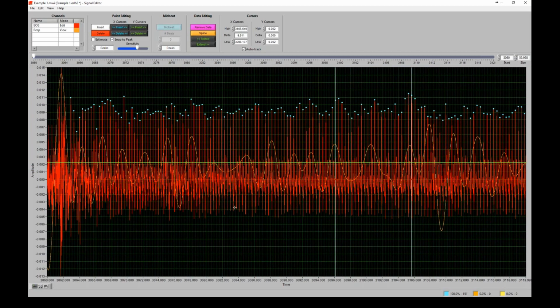If we zoom out, we can confirm that. So again, this sort of thing is completely acceptable to do as long as we, at the end of the day, end up with at least 30 seconds of data in this window. And again, that 30 seconds is based off of the number of respiratory cycles that we want to see, with 5 being the minimum and 10 being ideal. And this is particularly pertaining to respiratory sinus arrhythmia.